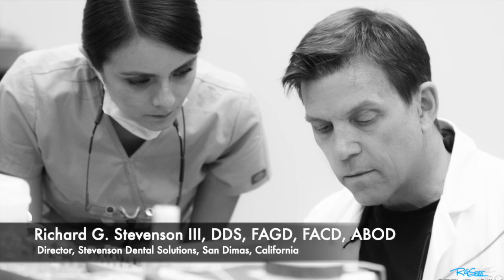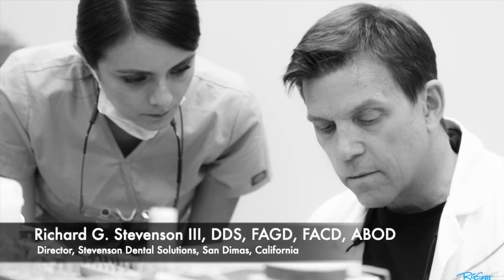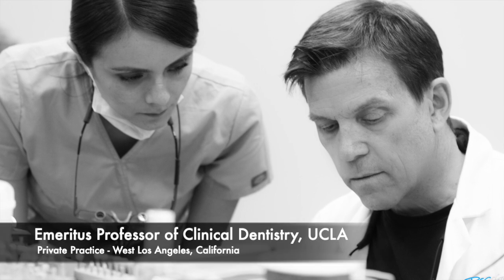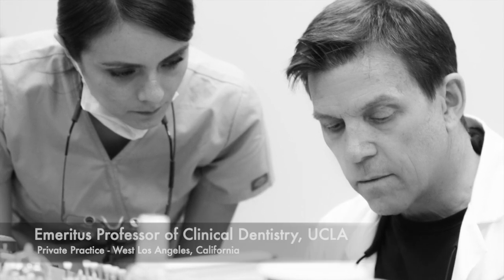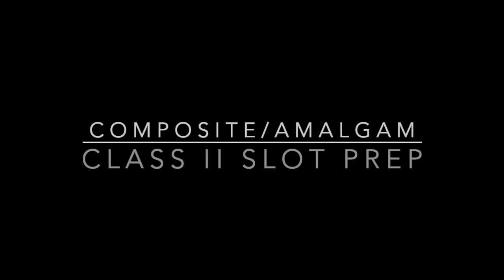Hi everybody, I'm Dr. Richard Stevenson, director of Stevenson Dental Solutions in San Demas, California, and I'm an emeritus professor of clinical dentistry at UCLA. Today we're going to talk about the slot preparation, so let's get going with the armamentaria.